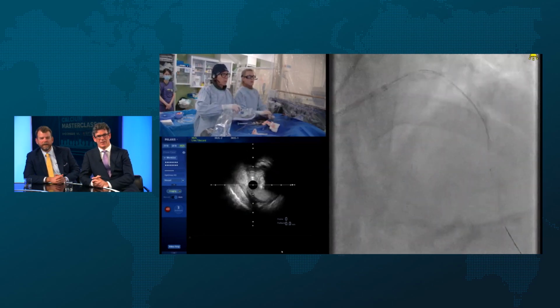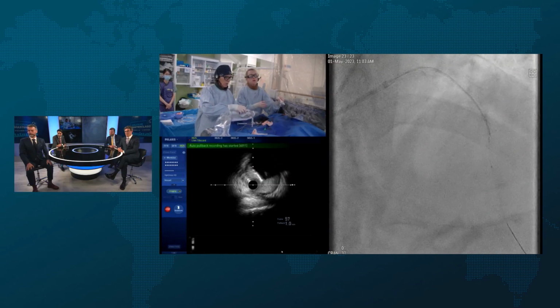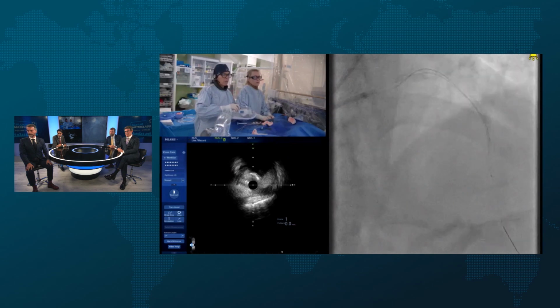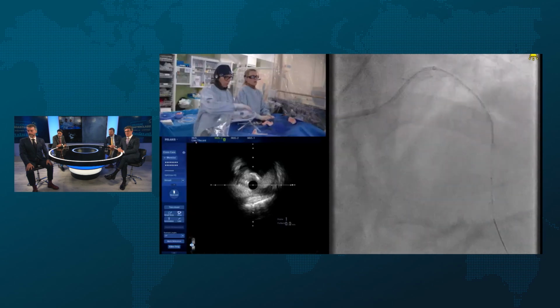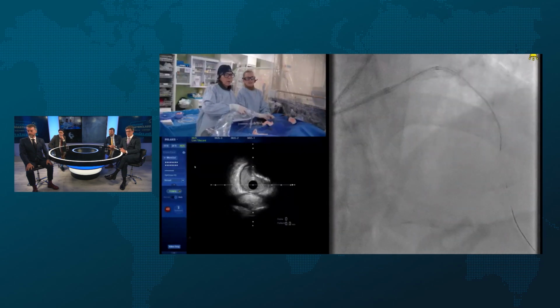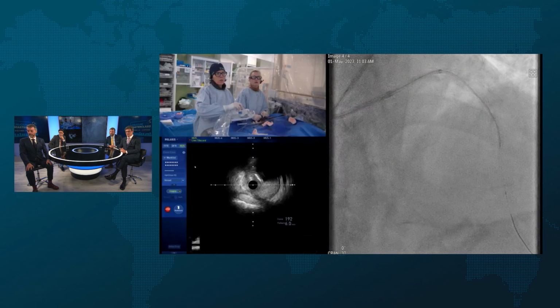The deformability. Yeah. Just a little bit beyond there would be nice if you could just show us the landing zone beyond. Okay, see if you can go a tiny bit further. Yeah, we're just at the edge of that nodule. I always like to talk about what ifs with cases because I think they're really instructive. Let's say somebody had live IVUS, and couldn't have gotten the IVL down, and we had to do atherectomy. Anybody have any issues with that? Very nice. Yeah, let's go there. Stop looking any further. So that's a good landing zone there. Yeah. We'll take that.